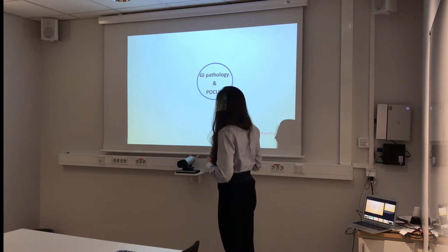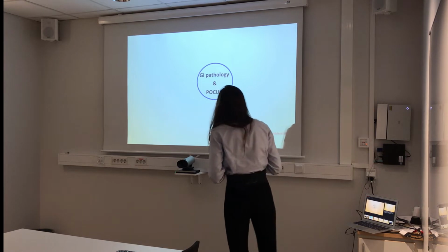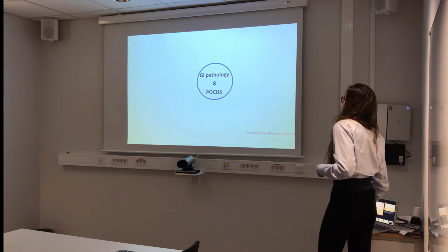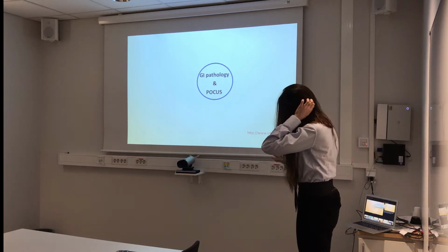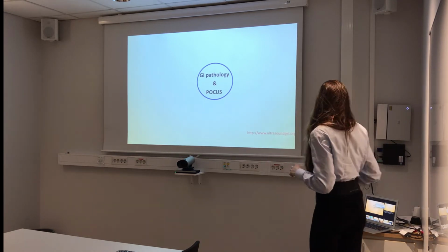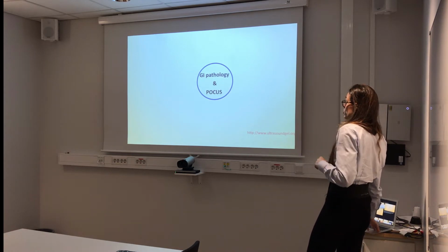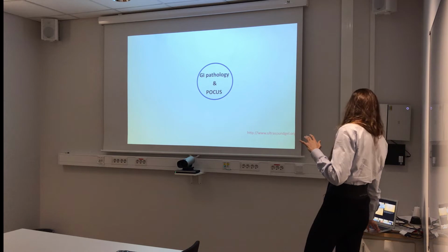So let's talk about GI pathology. The gastrointestinal pathology with the point of care ultrasound. When we think about what we can see with the point of care ultrasound in our abdomen, besides the EFAST, which is what we know, the classic knowledge regarding point of care ultrasound in the abdomen related to trauma, so it's very specific to trauma.